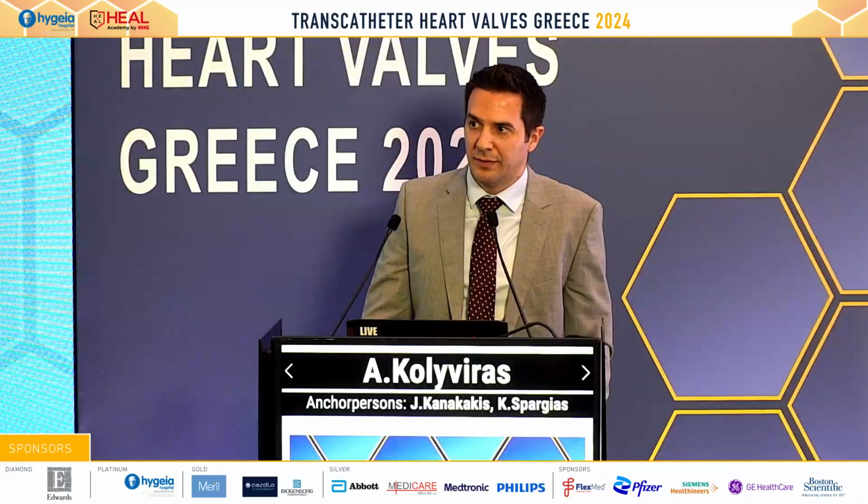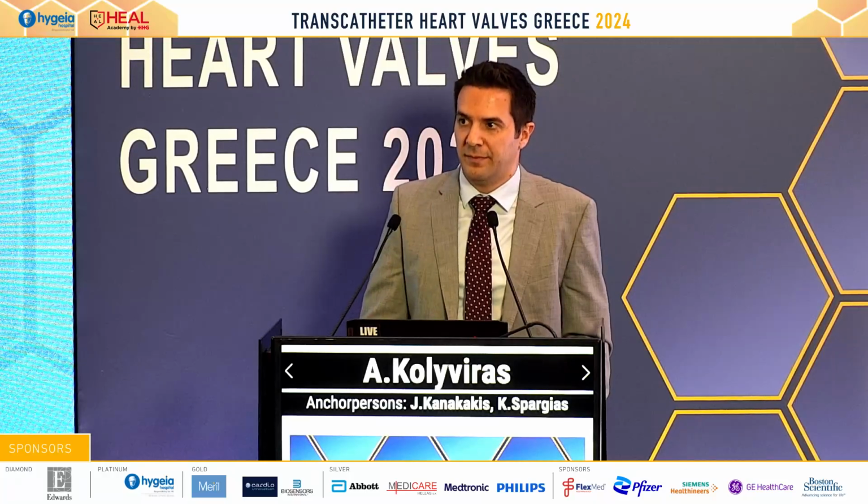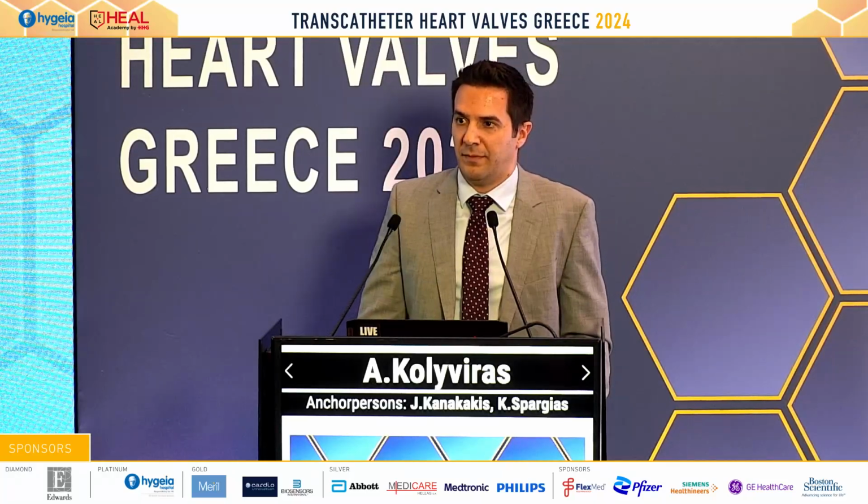This is a very good comment. In our daily practice, do not forget that. Yes, we do the same. We use fluoro and echo. It can save the day. And beware of arteries, common femorals, with a diameter less than 6 millimeters, because the anchor of the MANTA can cause obstruction.